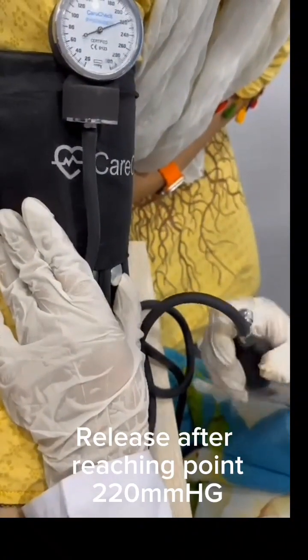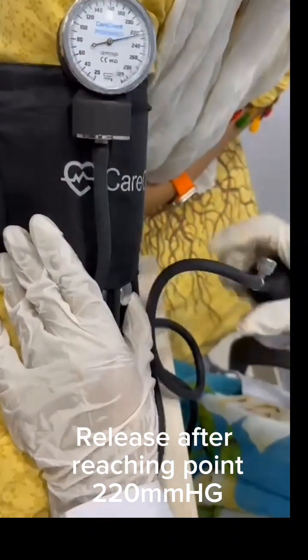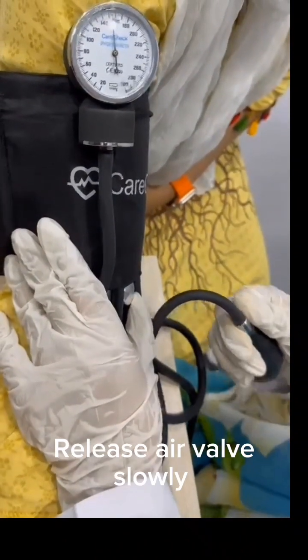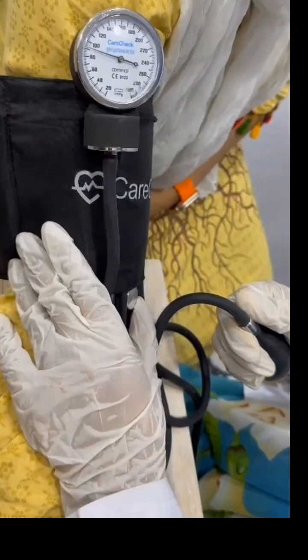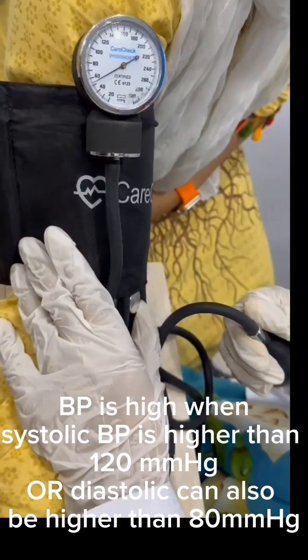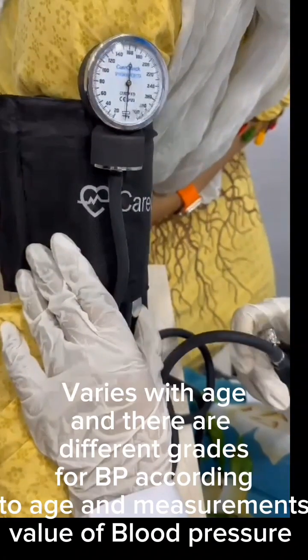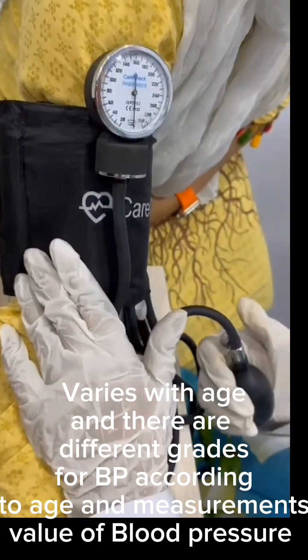Ideal BP is 120 by 80. Release after reaching 220. BP is different in different positions. BP falls in standing position. That's why walking is recommended to hypertensive patients. There are different grades of BP and variation of BP with age.